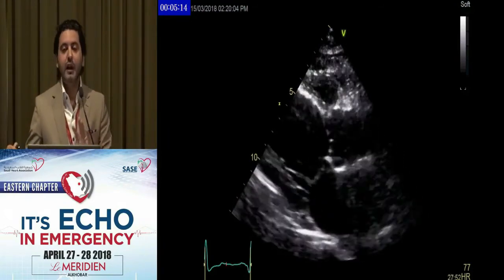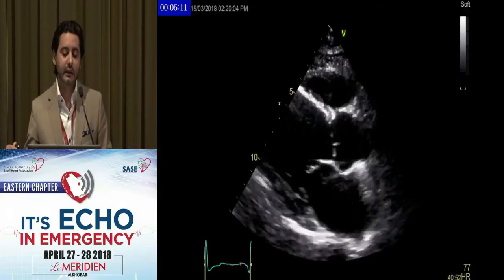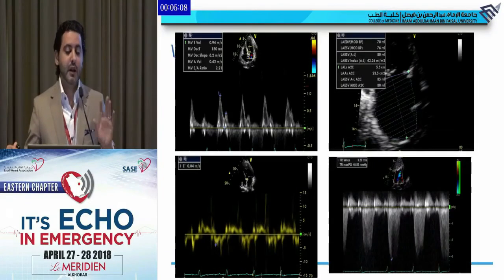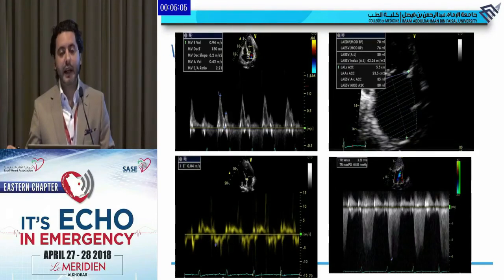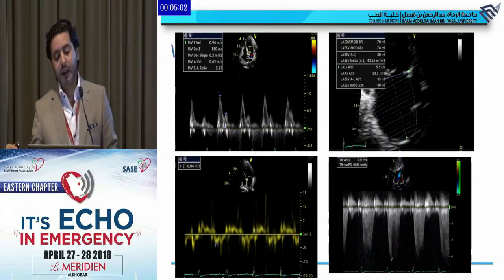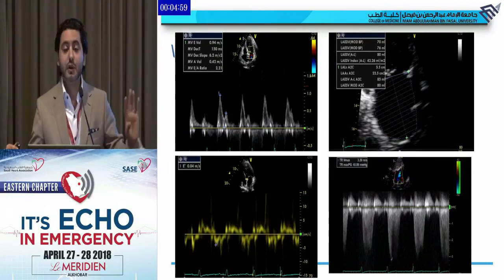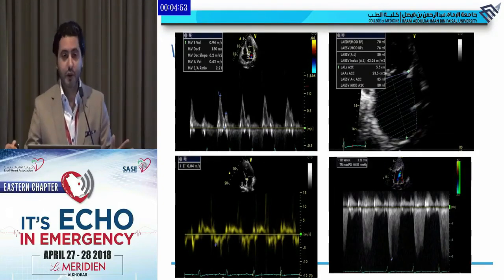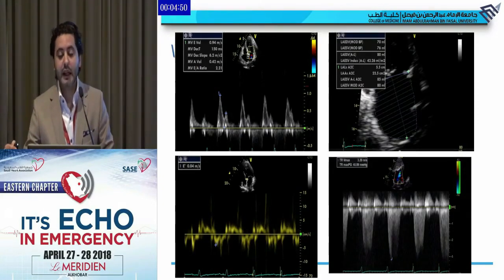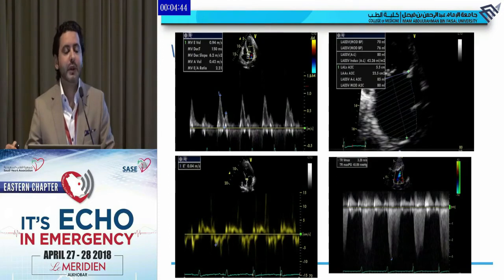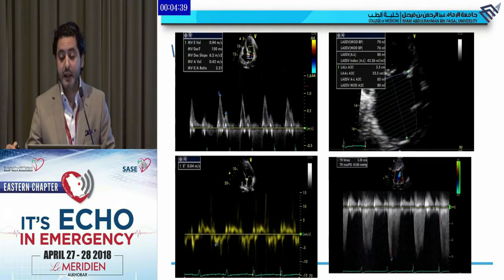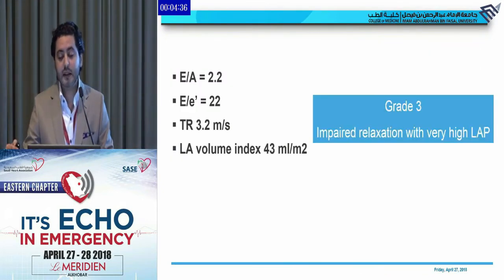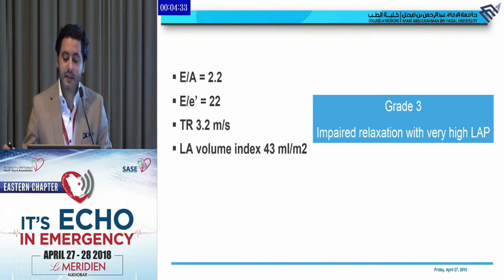Another example — you have this abnormal heart, so you know diastolic function will be abnormal. Looking at the E over A ratio, it is 2.2, so you can stop here and say grade 3, meaning LA pressure is high. If you want to complete the diastolic assessment: LA volume is 43 ml/m² — dilated. E over E prime is approximately 22. TR velocity is 3.2. The conclusion is grade 3 diastolic dysfunction — impaired relaxation with very high LA pressure.